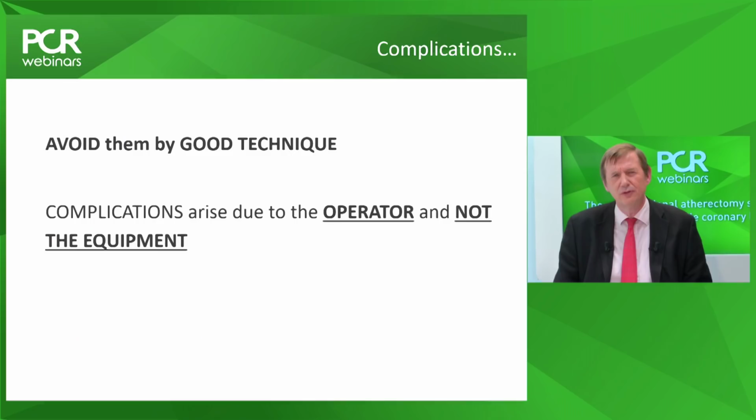Now, just to put this in perspective, rotational atherectomy has been associated by its traditional use with heavy burrs and high speeds in order to debulk arteries. There has been a raft of complications associated with trying to achieve that, and that's rather haunted the device into contemporary practice, which is now completely different, with smaller burrs and shorter runs. And so the traditional complications still exist, and we're going to see a few of them and have a chat about how to avoid them.